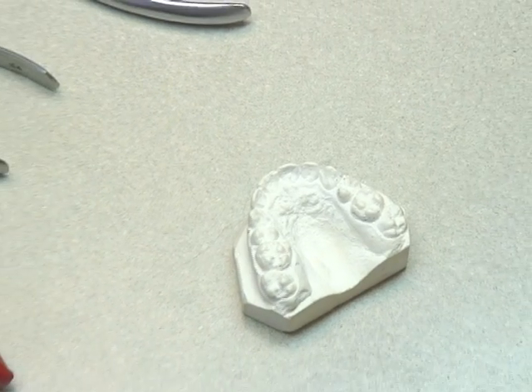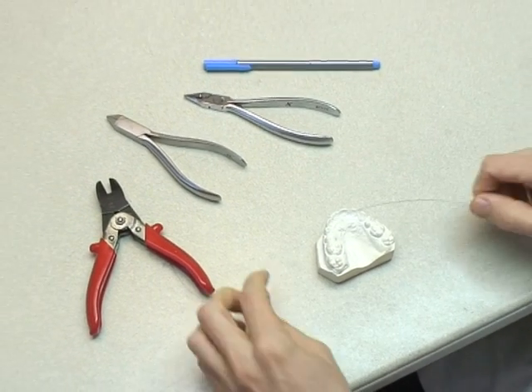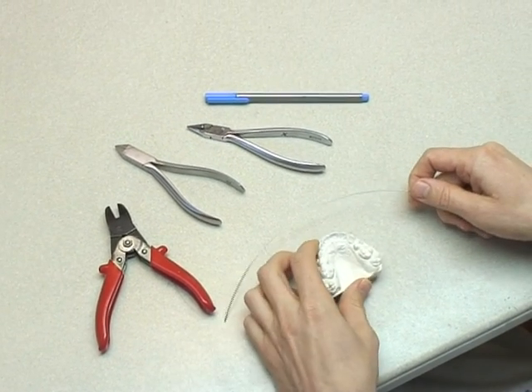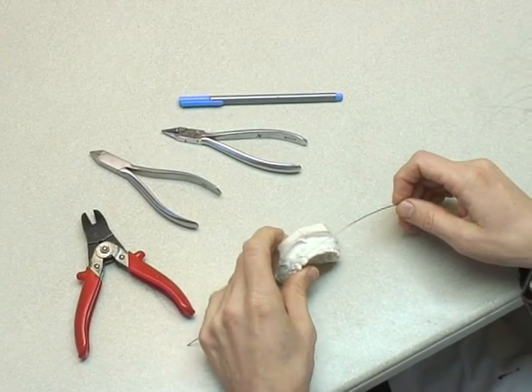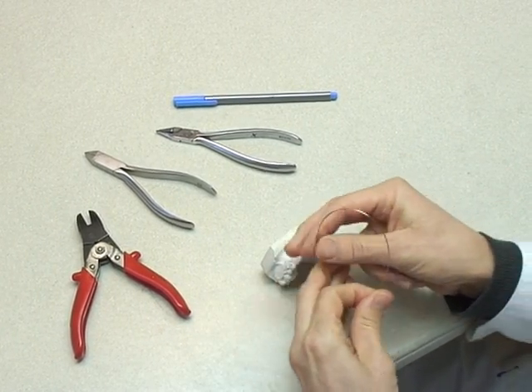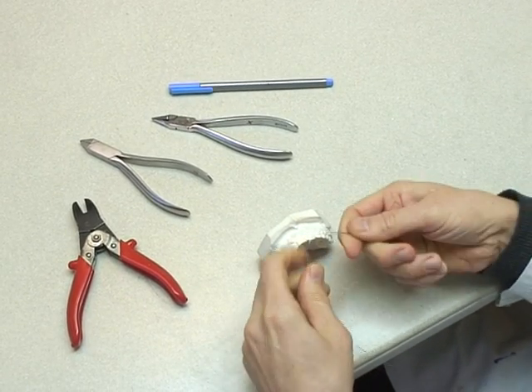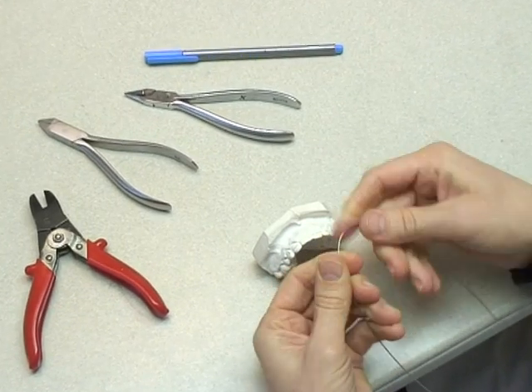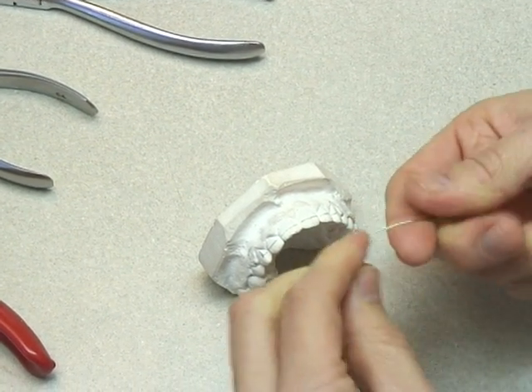The Hawley retainer is used at the end of treatment. Therefore, the arches that you see on the models are usually ideal in shape. The teeth are in the position that they've been moved to at the end of treatment, and this component is purely there to keep them in that position, to prevent any relapse, and to retain the teeth in their new positions — hence the term retainer.